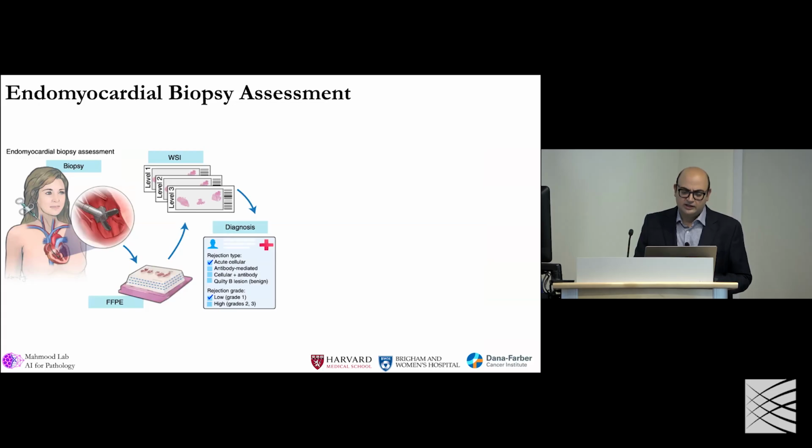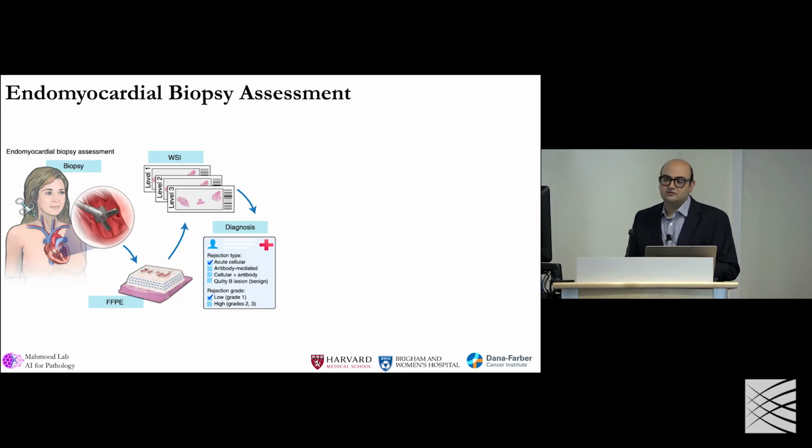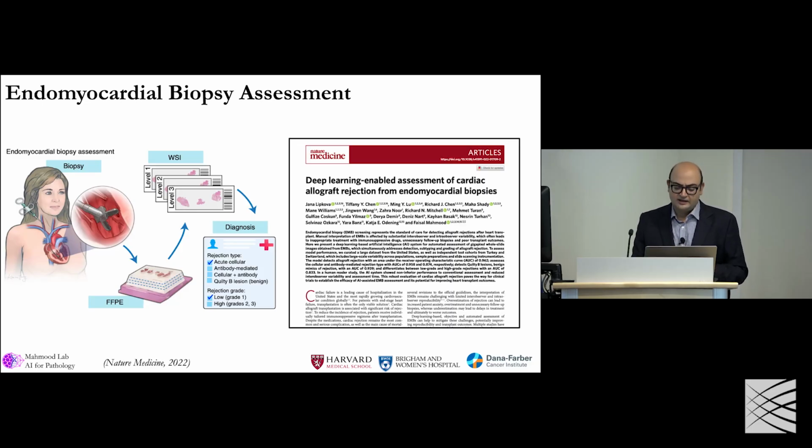Another application we targeted using the same sort of paradigm was endomyocardial biopsy assessments after heart transplants. Patients often undergo repeated endomyocardial biopsies, or heart biopsies, to determine if the donor heart is being rejected by the recipient. This is a problem where there is large inter- and intra-observer variability, and we wanted to see if it's possible to standardize this a little bit more using these machine learning techniques. This was a study from back in 2022. I won't go into the details, but there's a lot of analysis around what happens when you have human-in-the-loop assessments for these biopsies.